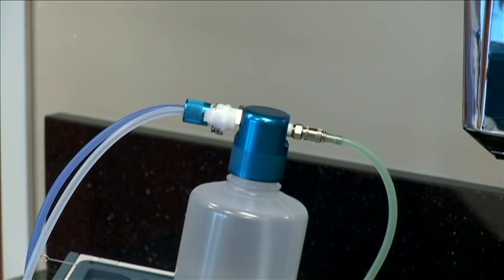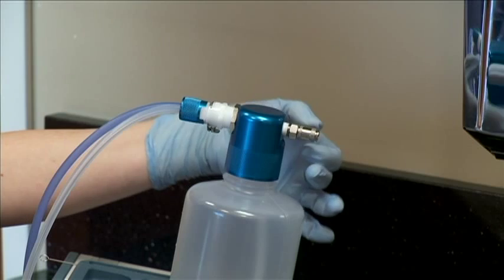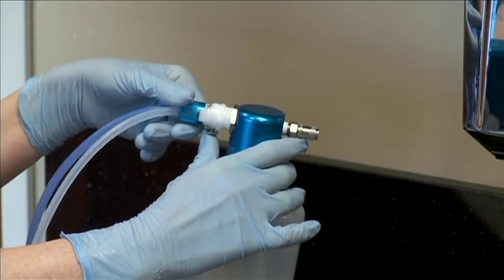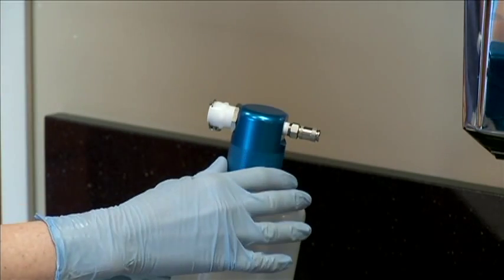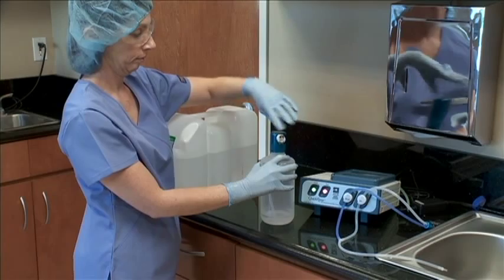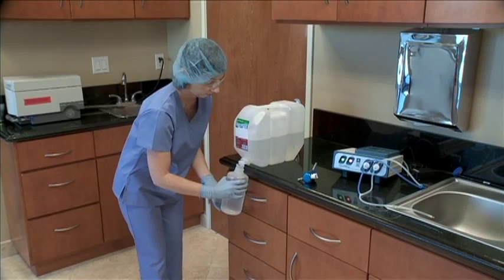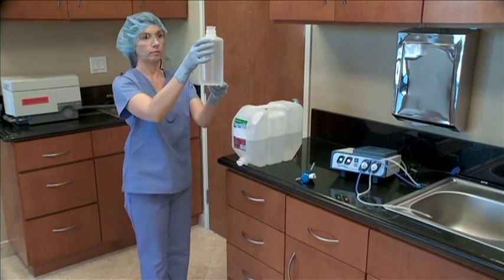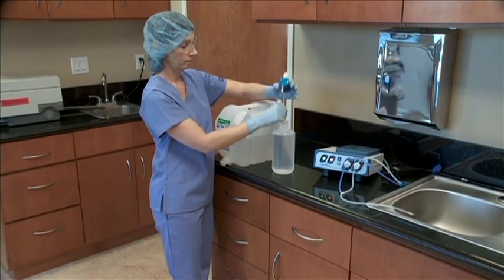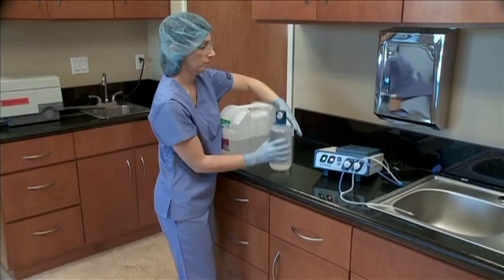To refill the fluid container, disconnect the green air supply tubing from the fluid container cap to release any remaining pressure in the system and to avoid spilling excess fluid. Next, disconnect the air and fluid tubing from the white plastic fitting on the fluid container cap. Remove the fluid container cap by turning counter-clockwise. Fill the fluid container with distilled or sterile water, making sure to leave one inch of space from the bottom of the bottle cap to ensure proper operation. Screw back on the fluid container cap, placing the fluid container back in the well and reconnecting the tubing.